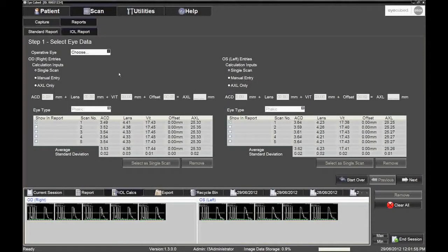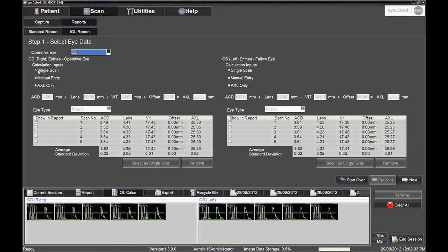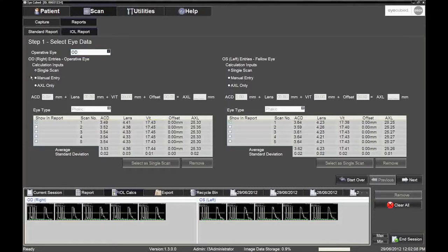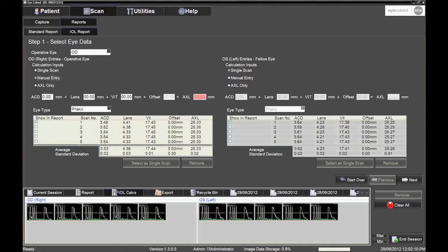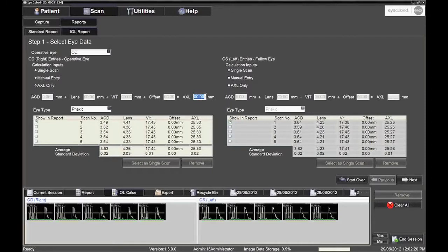The screen with variables previously chosen by the physician will appear. Step 1. Ensure the correct operative eye is selected. Selecting Single scan allows for the default values to load. Selecting Manual entry allows the user to adjust the ACD, lens and vitreous values. Selecting Axial only allows the user to adjust the axial length. Click the Next button.